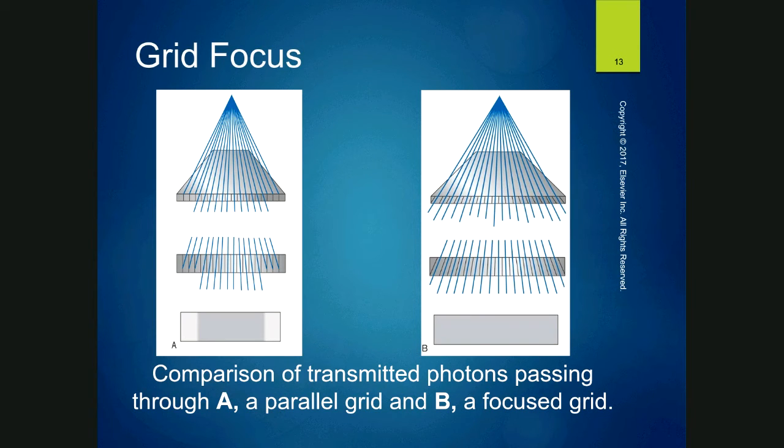So when you're looking at your grid, your X-ray beam is coming out as a point source. Remember, your spot on your anode is tiny. It's like maybe 1 millimeter. So that's 1/10 of a centimeter, just small, right? You guys hopefully remember that a millimeter is 1/10 of a centimeter.